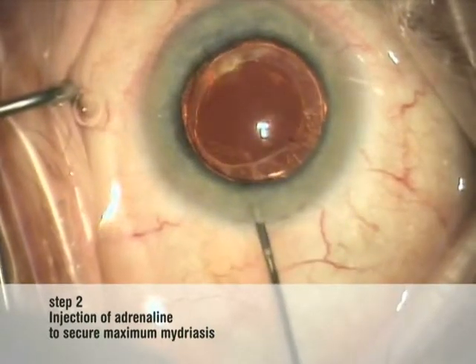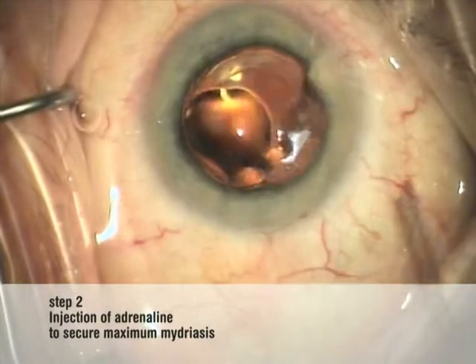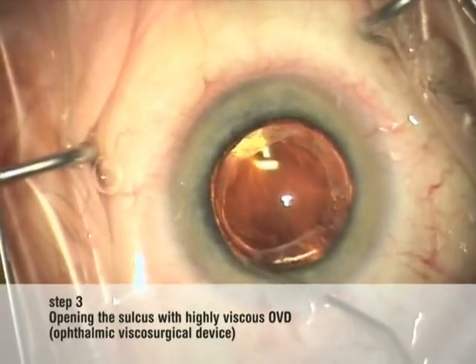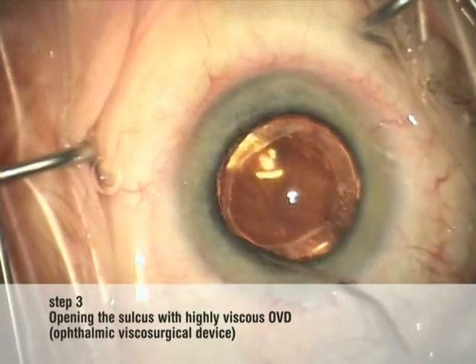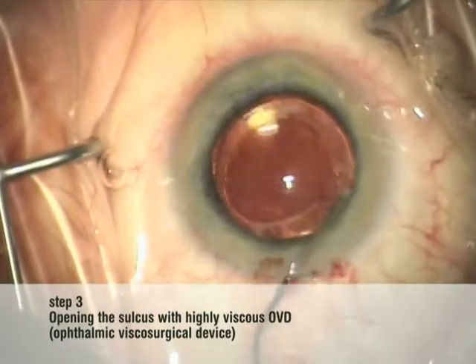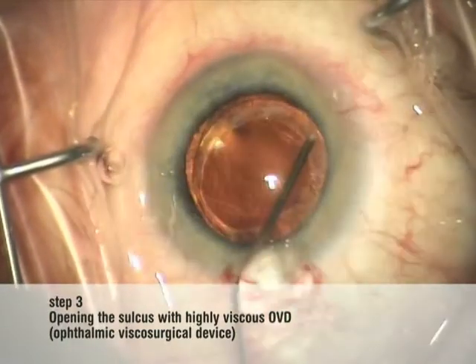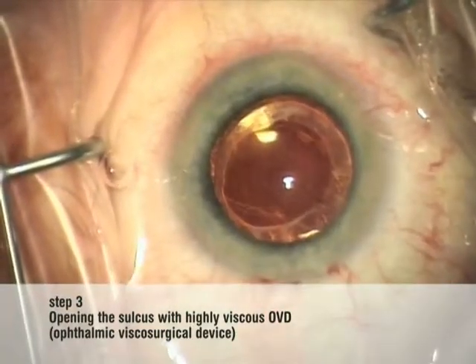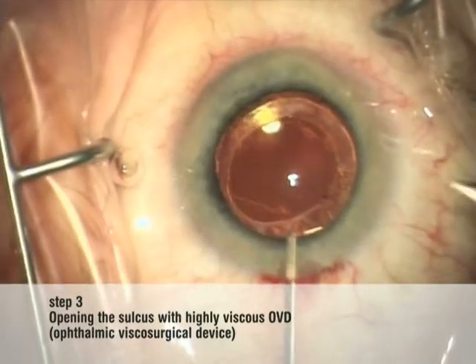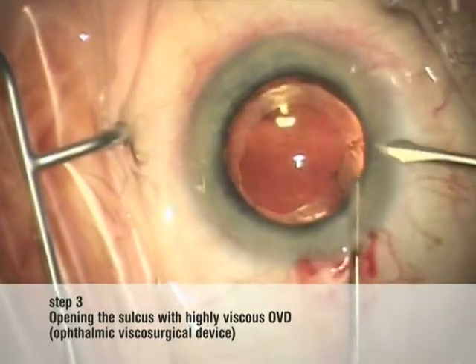The anterior chamber is filled with highly viscous OVD. Then the sulcus is opened with an OVD depot. Remember that the posterior capsule has already been opened, so caution is taken not to open the capsular bag with OVD and not to apply too much pressure on the capsular bag IOL and the vitreous behind the IOL.